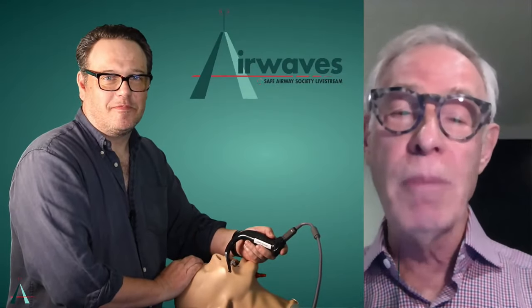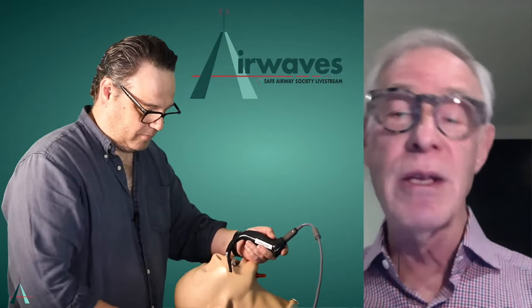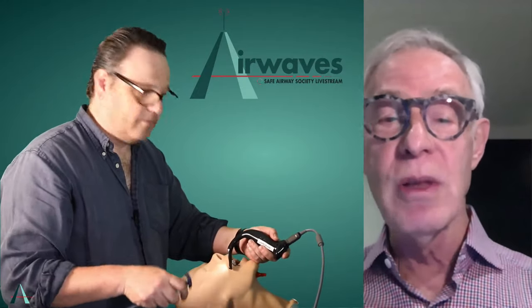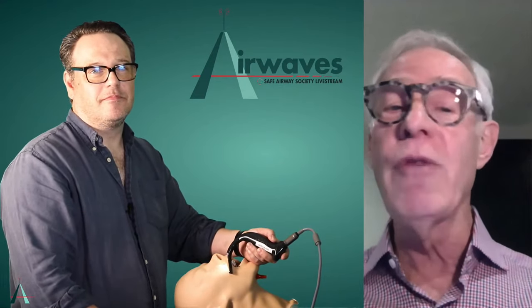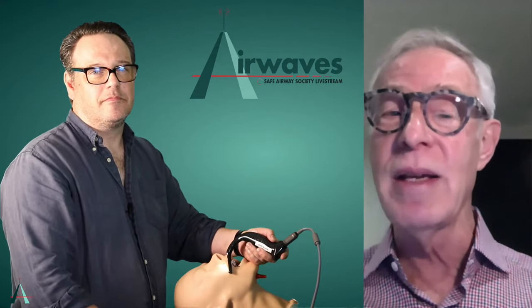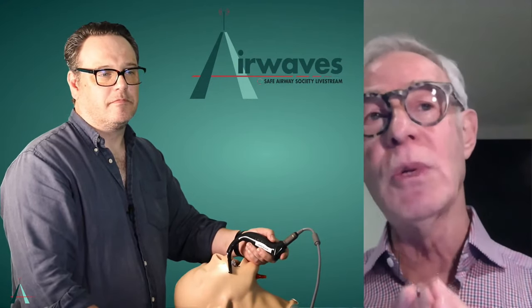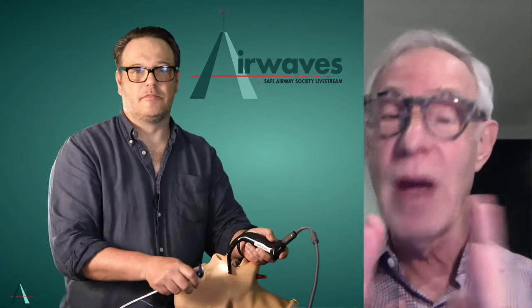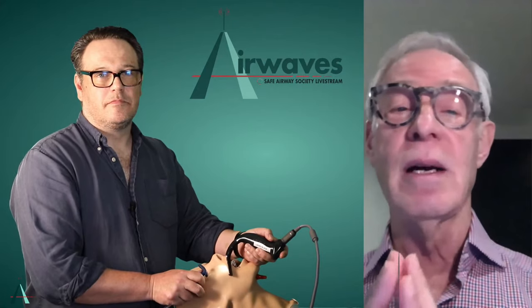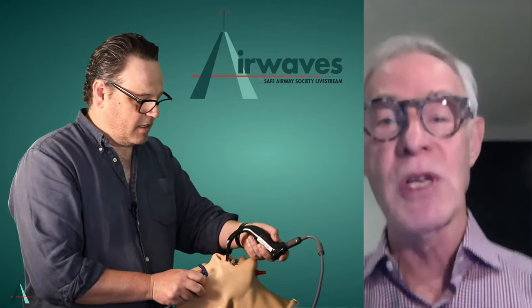No, and then I just optimize the laryngoscope and the relationship between the left hand and the right hand. So I position that my image is vertically oriented, and very often people will be slightly to the side, so that it's like trying to insert an endotracheal tube tangentially. And I'd rather face the larynx directly on, so that it's properly centered.